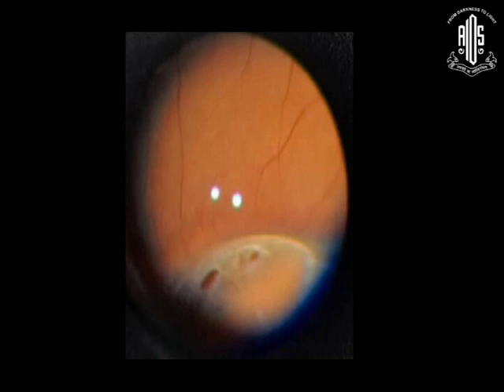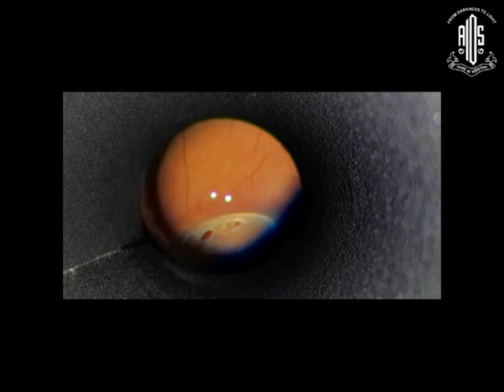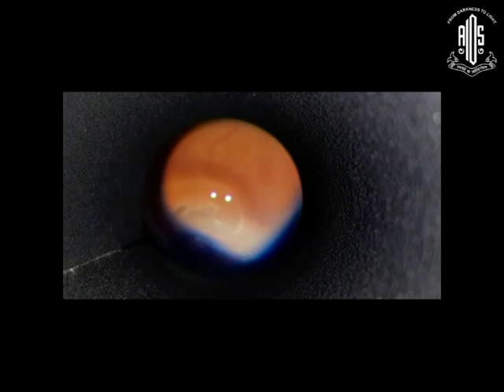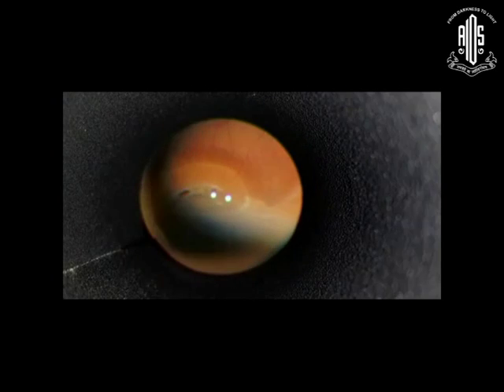Now, scleral depression is something which a normal fundus camera cannot reach. Even ultrawide imaging can't reach up to the pars plana. But this technique can. You can see a subclinical retinal detachment here, and there's an atrophic hole. When you look here, that is the pars plana, and that is all of the retina. So you are able to reach up to that area with this technique.